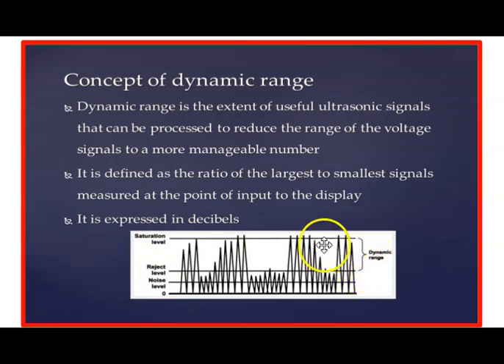This is your dynamic range that it has selected, in the amplitude of signals coming back to the machine from the image to determine brightness of that image. It's all done by either suppressing or accepting these amplitude signals coming back from our image.